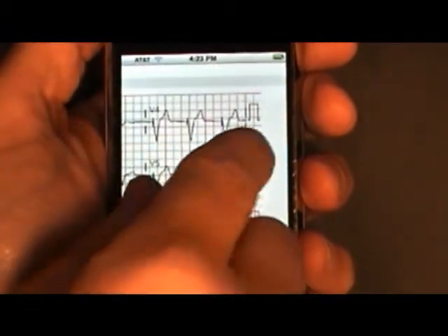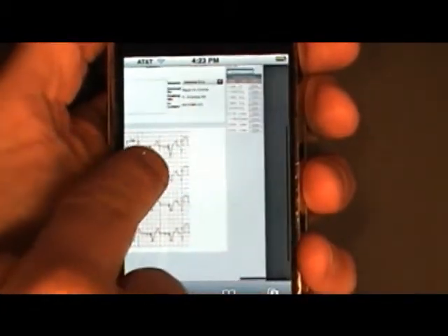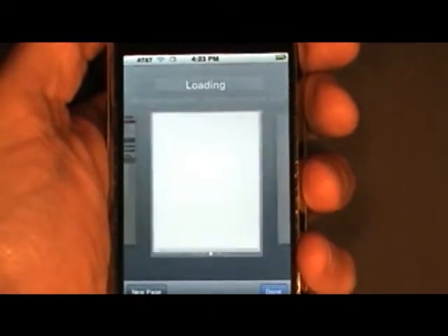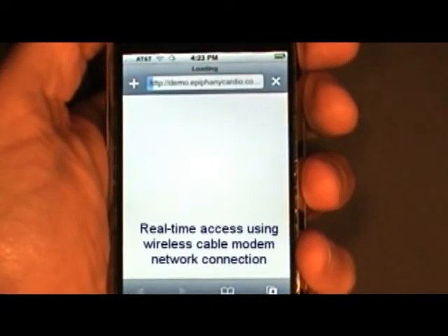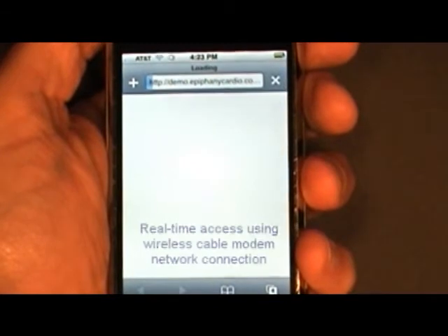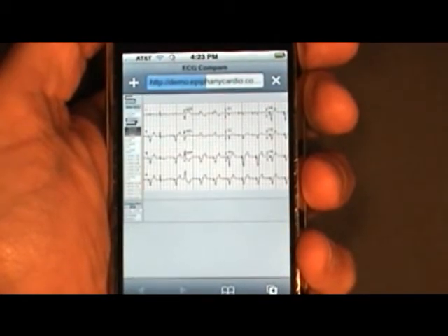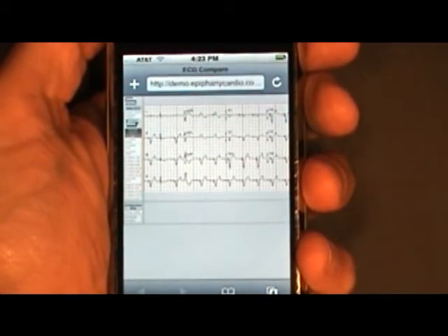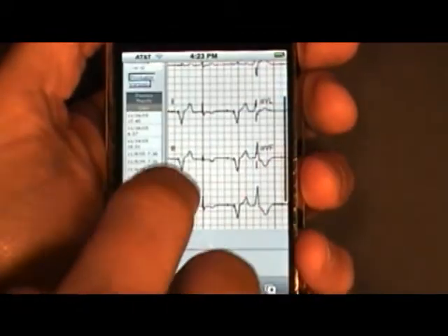Now, what if you want to compare ECGs side by side? Well, in that case, we'll go ahead and select the Compare ECG button. One note I wanted to make is that I'm using a wireless cable modem to access these studies to give you a sense of the load times. And again, that can vary depending on your own internet connections.